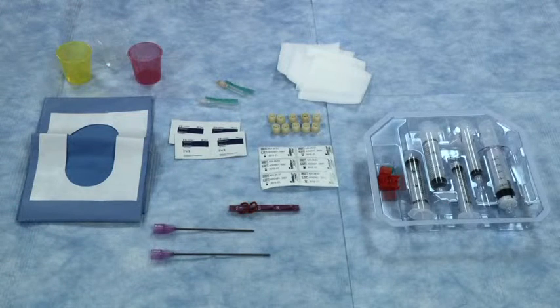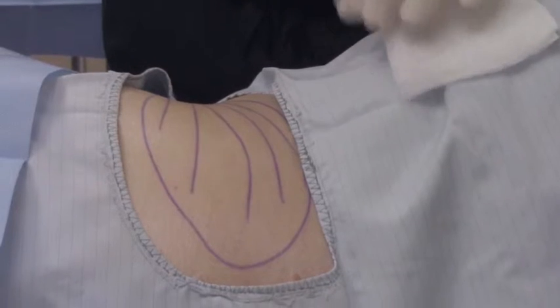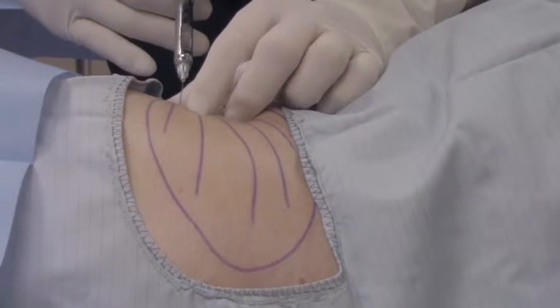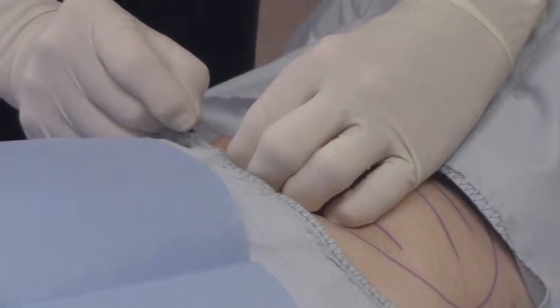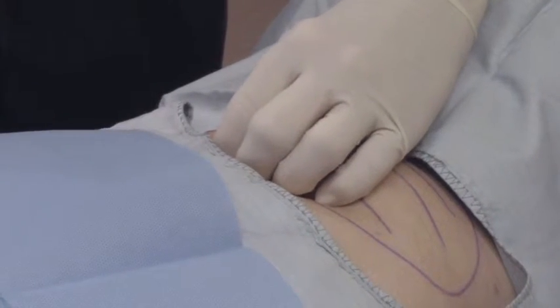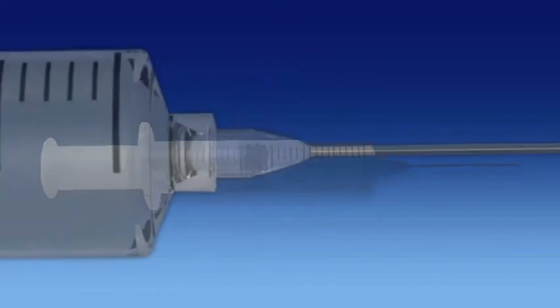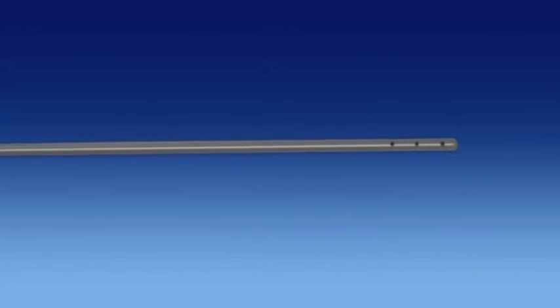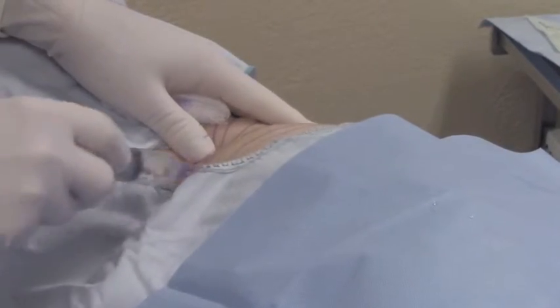Prior to the start of lipoaspirate processing, all contents within the procedure pack should be opened within the sterile field. The donor site should be prepared following sterile and aseptic technique. A sterile drape is provided to isolate the donor site. Anesthetize the donor puncture site with the 25 gauge needle provided. Create a puncture hole through the skin only using the 18 gauge needle. Insert the cannula through the skin puncture site, entering the subdermal fat layer.